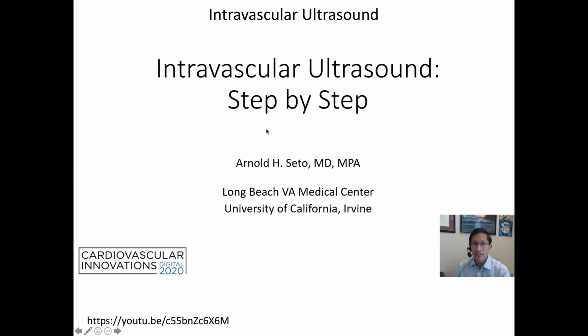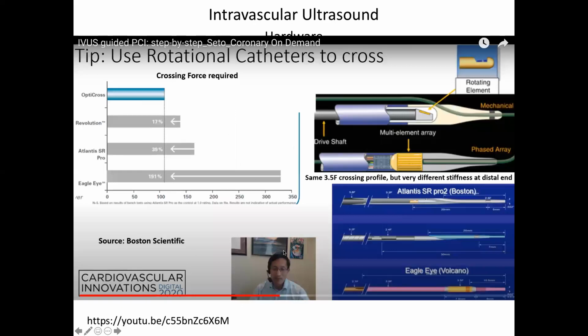So the next thing we'll look at is these intravascular ultrasound catheters. And these are catheters that are a millimeter, couple of millimeters in diameter, or even less. You put them into an artery, and you can put them in the radial artery or in the femoral artery, move them all the way up to the coronary, and then push them down the coronary and take a look at what kind of lesions you're dealing with in a coronary artery. And so this is on YouTube. This guy does a great job of explaining this field.